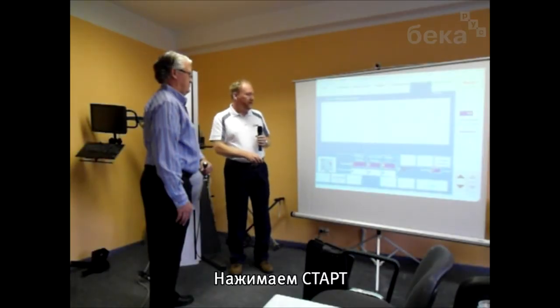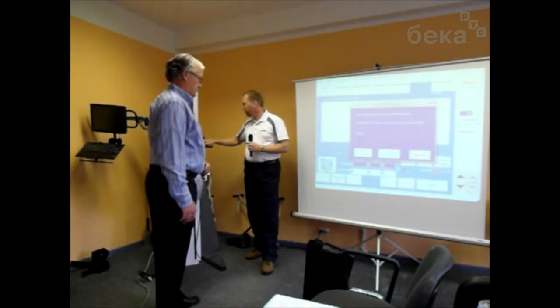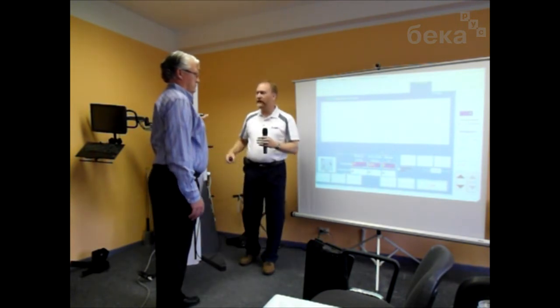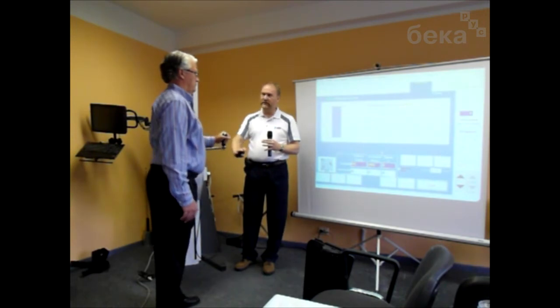So when we press the start button, you ready to start? Okay, whenever you're ready. And then slow down, and push out, and resist it down.